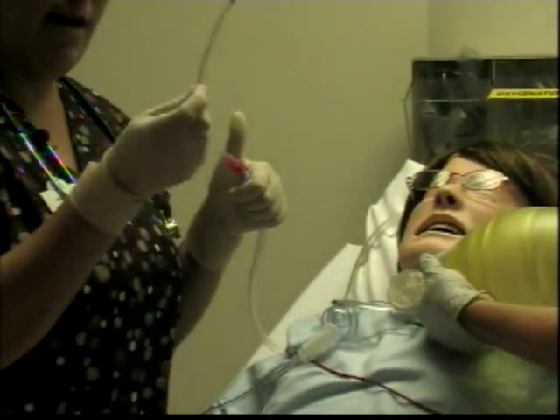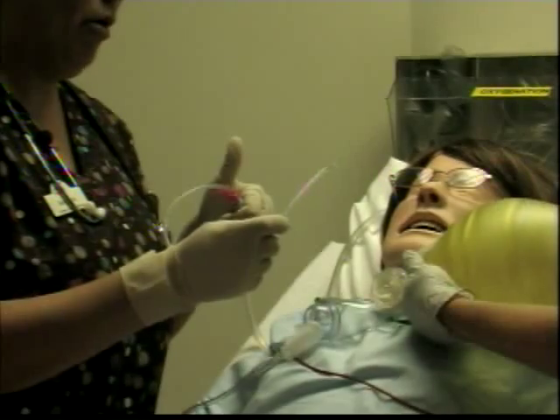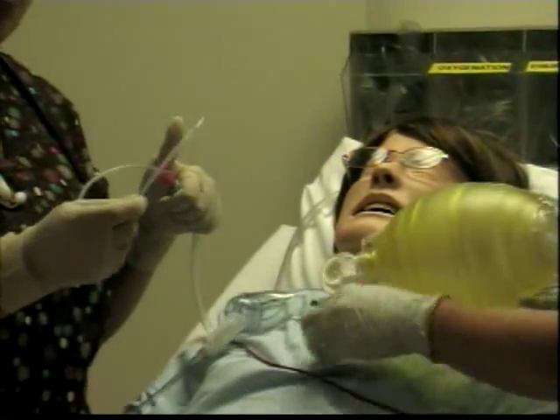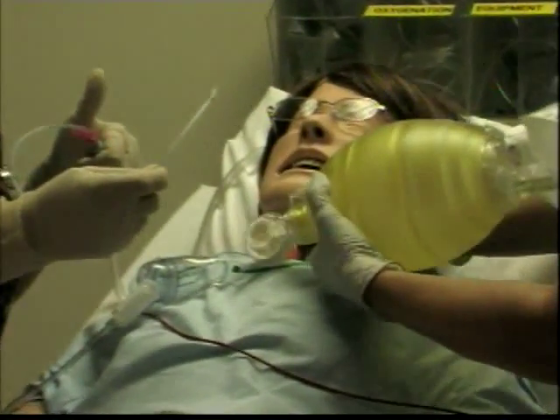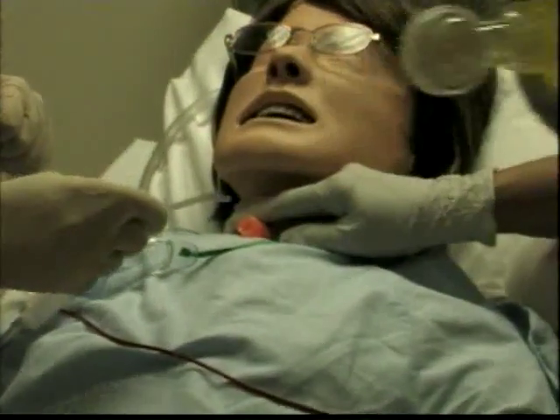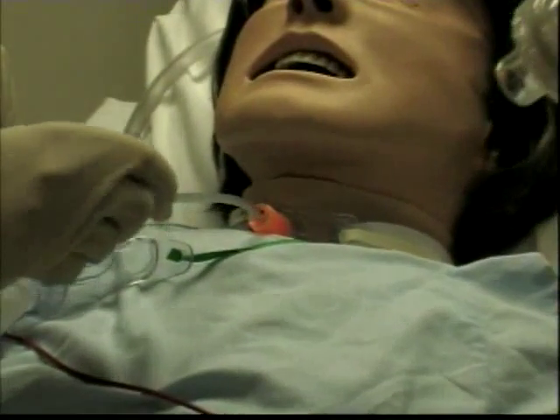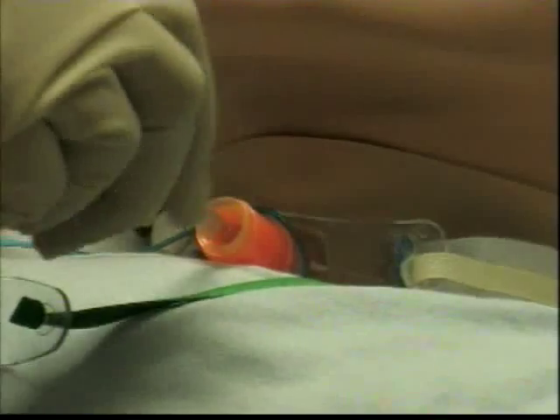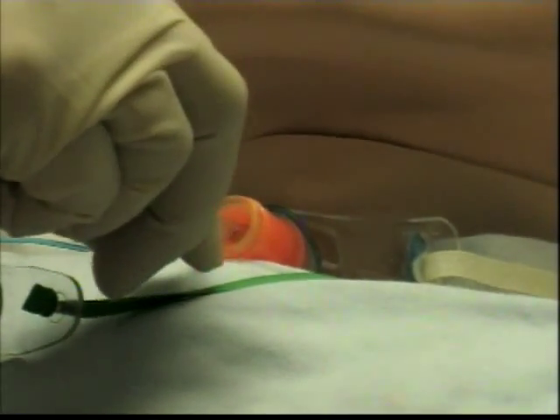Just up. And then I'm holding this with this hand. You're going to be going about 1 to 2 inches down, or if the patient starts coughing, then you start withdrawing. Okay, Ms. Shapiro, now I'm going to go in and suction. So now I'm putting the catheter in, and I'm going about 1 to 2 inches down. She's going to start coughing, and when she does that, then I'm going to apply intermittent suction. At the same time, I'm twisting and I am withdrawing.